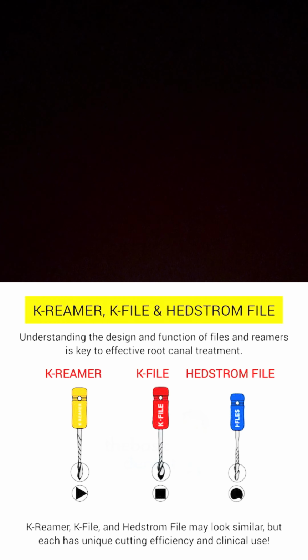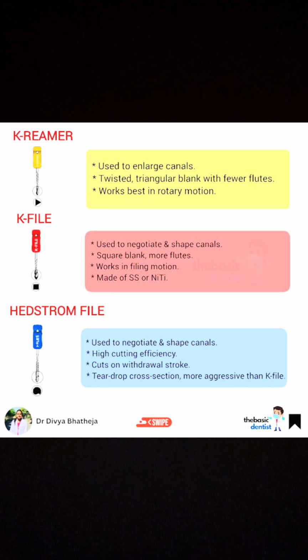As the use of the square blank results in instruments that resist fracture more effectively than those made from the triangular blank, they are generally used for smaller fragile instruments. When instrument fracture is no longer a critical factor, such as in larger instruments, triangular blank can be used.